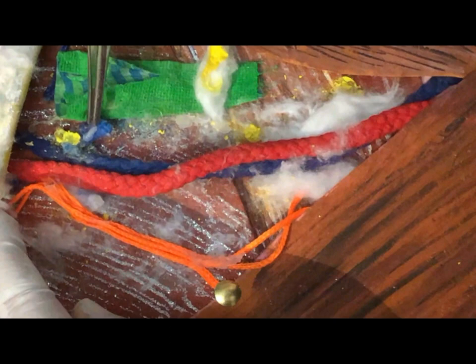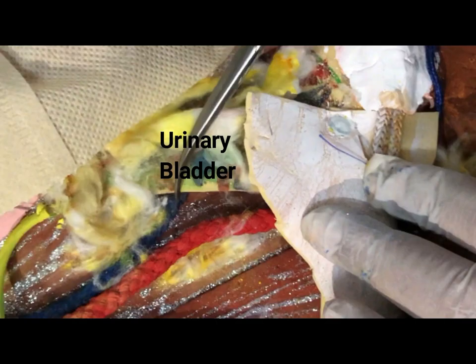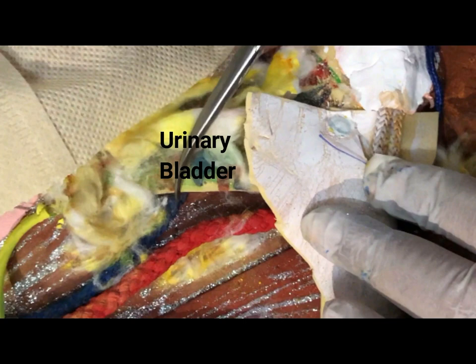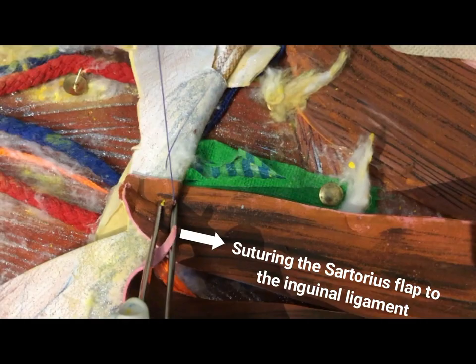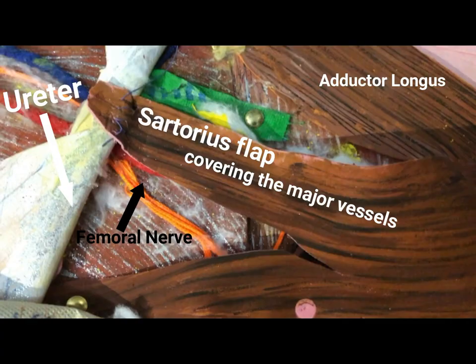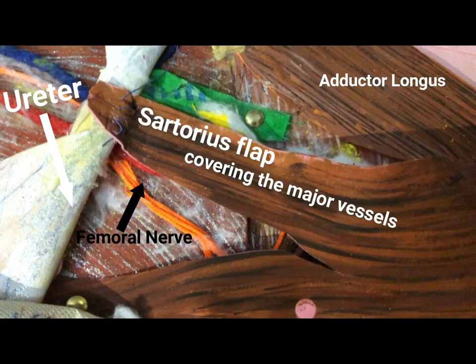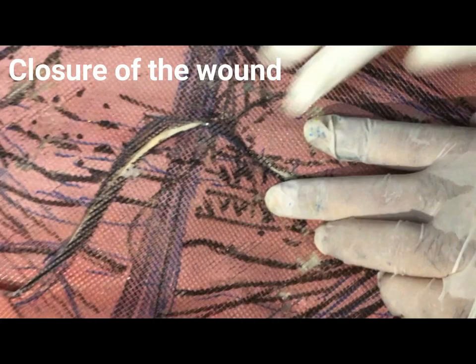The lazy S incision starts just about medial to the anterior superior iliac spine — about three to four centimeters medial to it — going parallel to the inguinal ligament, feeling for the femoral artery, and going medial to it so that the incision is not sitting on the major vessels. In case of flap failure, the vessel should not be exposed to the exterior, which is the reason for femoral blowout and is a cause of instant death in many cancer penis patients. This is the incision that suits most scenarios, and we will demonstrate it. We do not need thin flaps as in many other cancer surgeries.